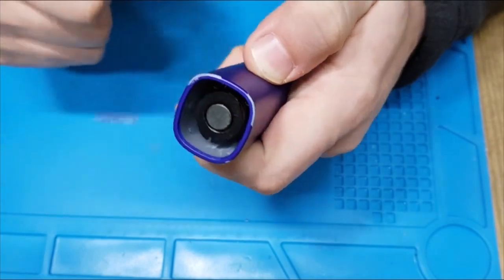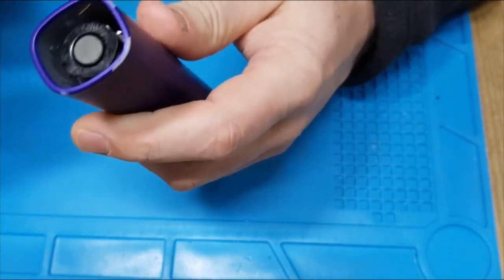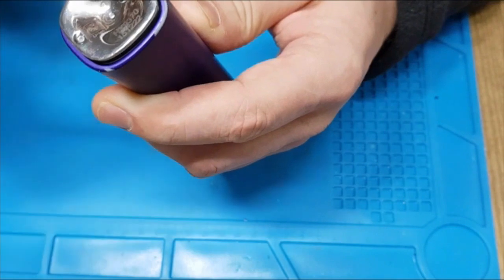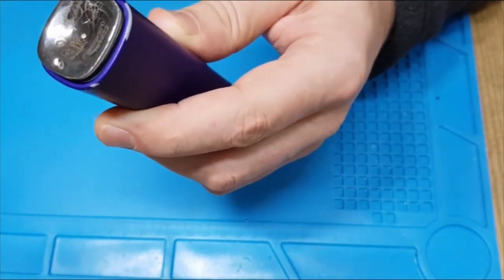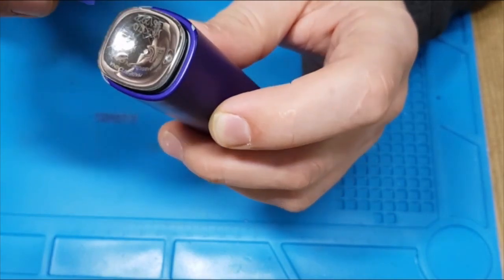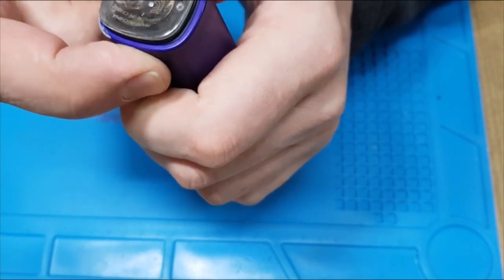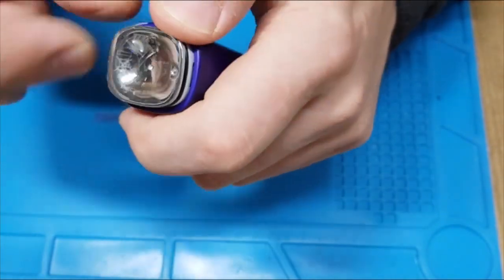So the clips jump in, and just to repeat it one more time, when you have the cover on, you press with the pliers diagonally, and when the gap appears on the side, you insert this spacer right on the side, and then when it's fixed in there, you retake the pliers and squeeze it on the sides. Then this part will jump out, and the cover will lift up.